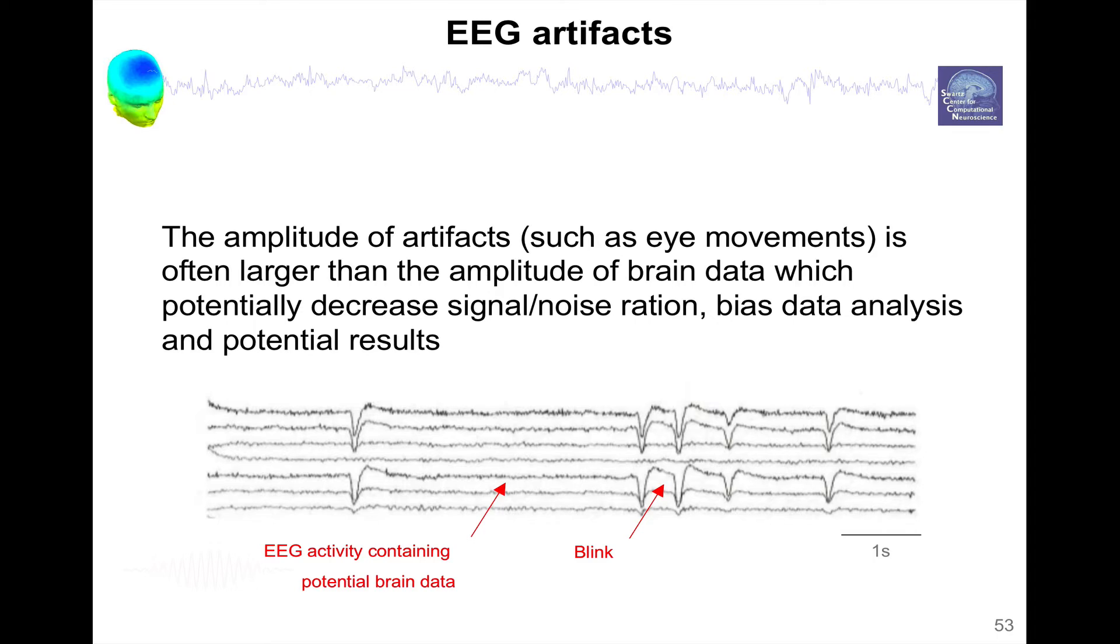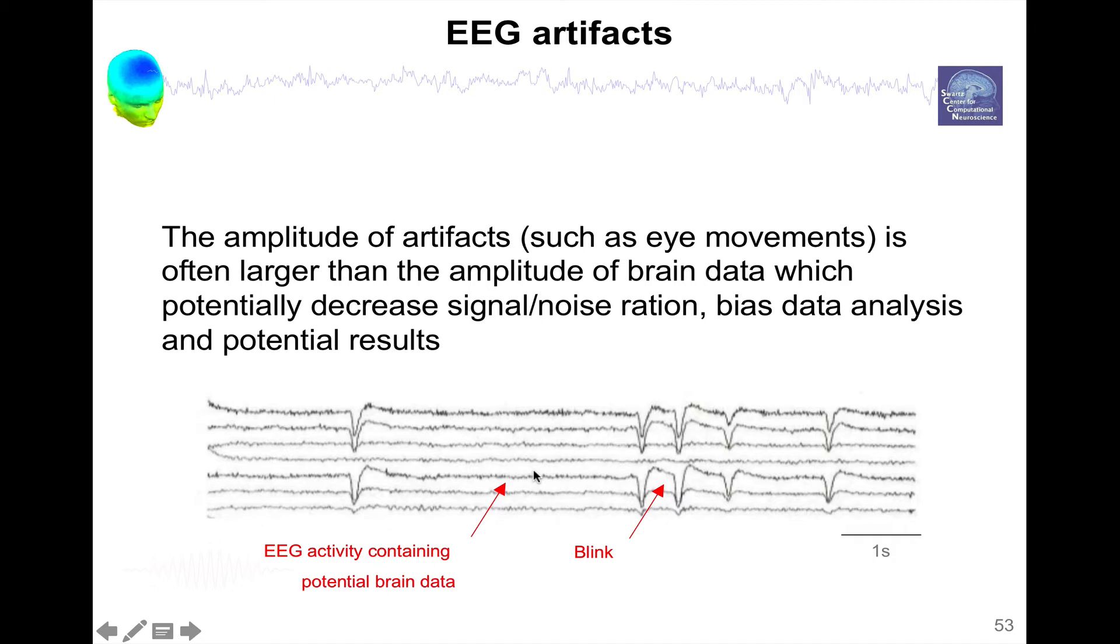For instance, this is EEG data, so this is background EEG data, and these are blinks. So you can see the amplitude of the blink is an order of magnitude higher than the underlying brain data.